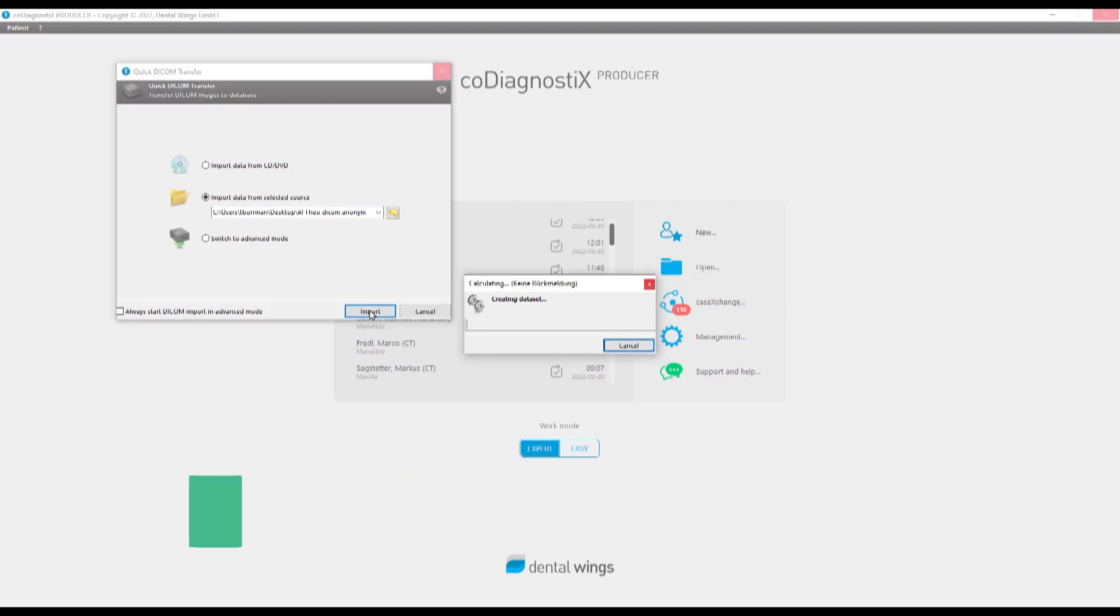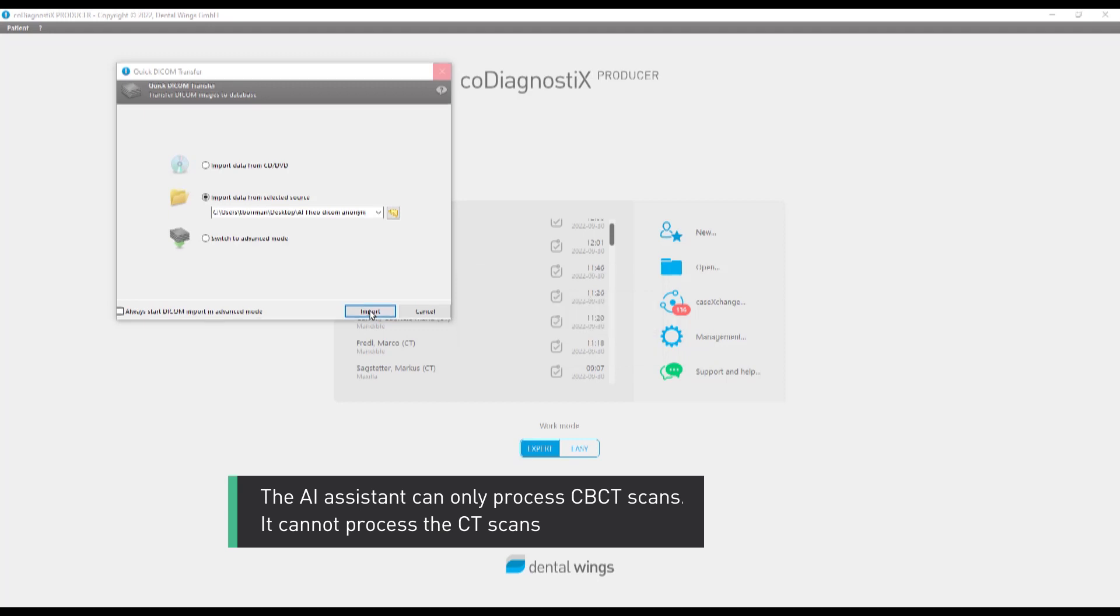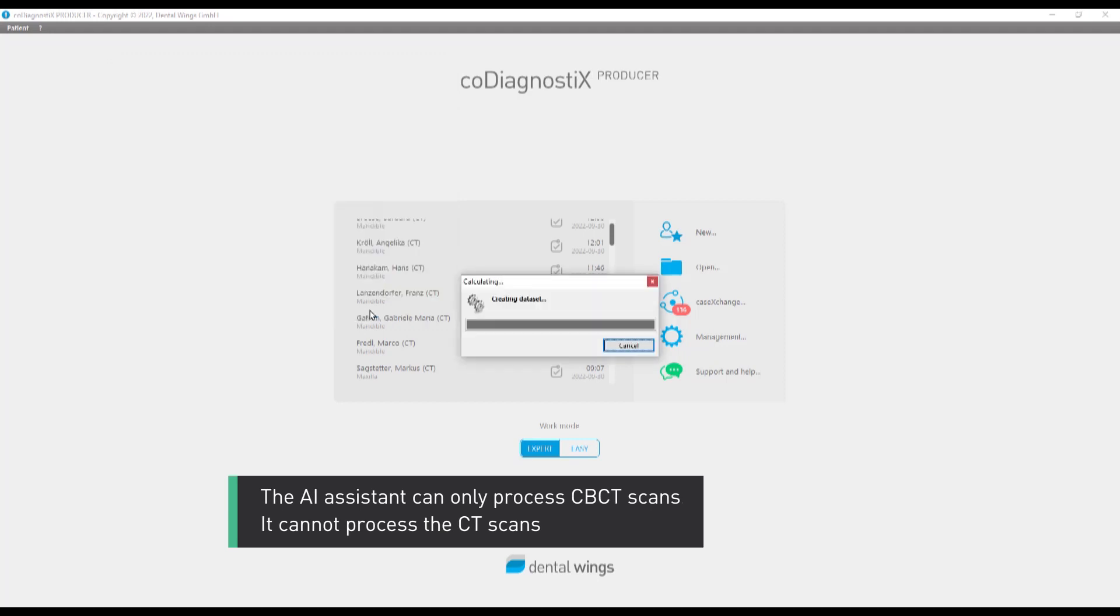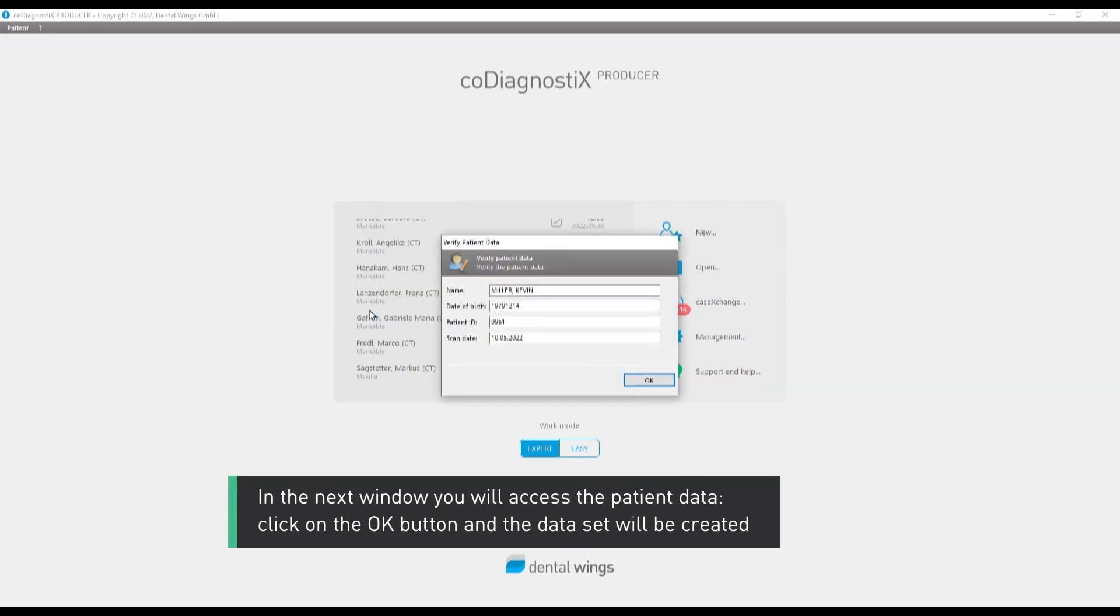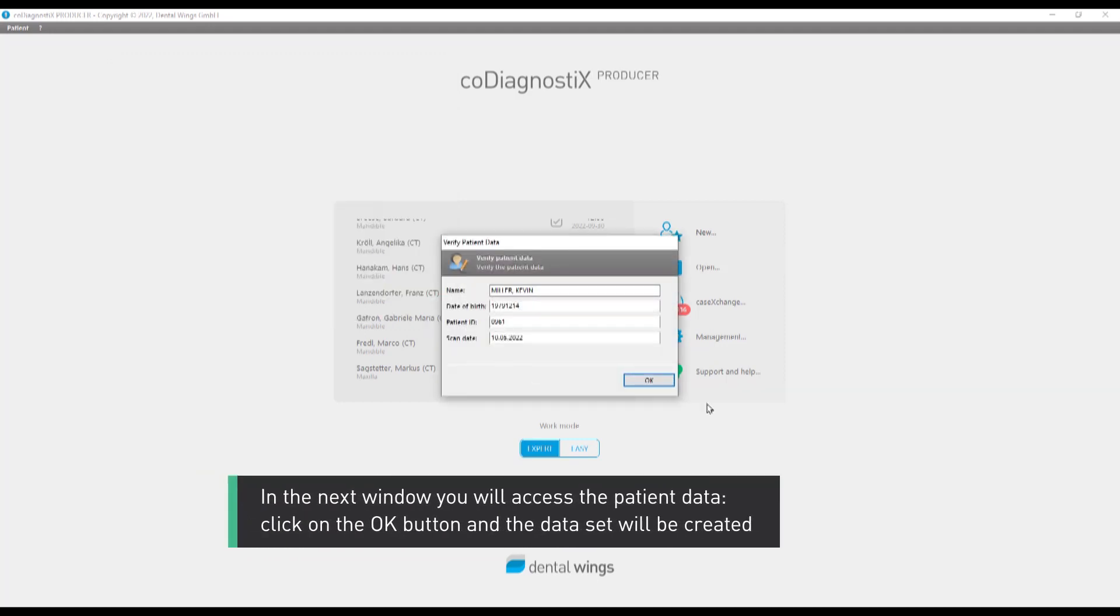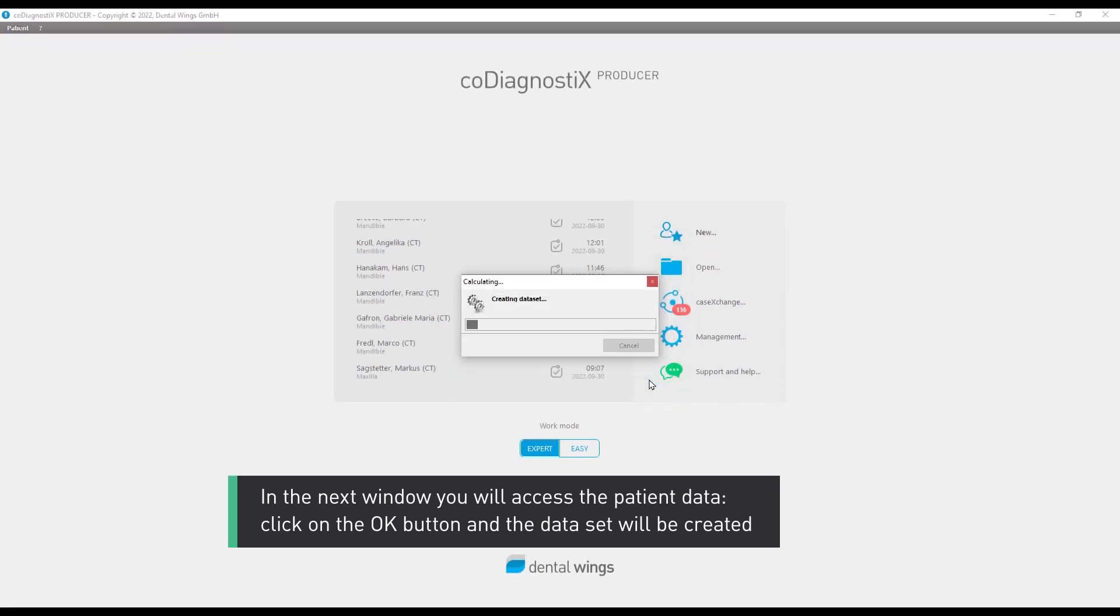The AI assistant can only process CBCT scans. It can't process CT scans. In the next window, you will access the patient data. Click on the OK button and the dataset will be created.